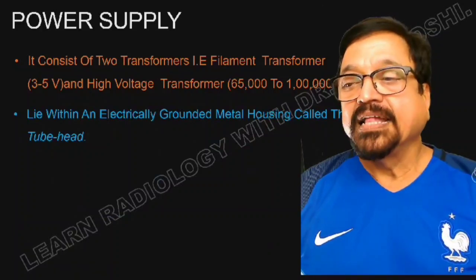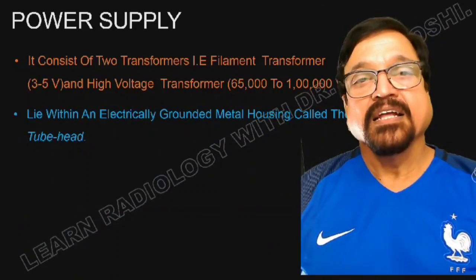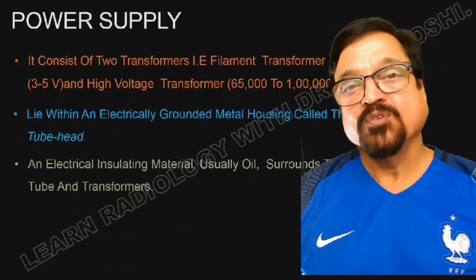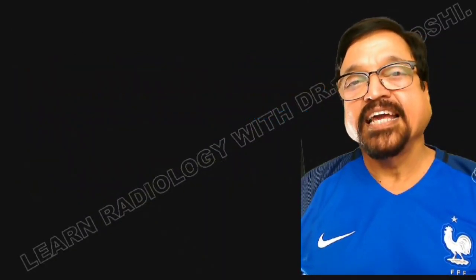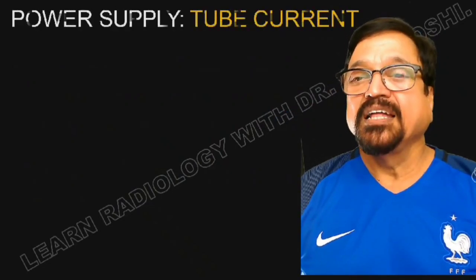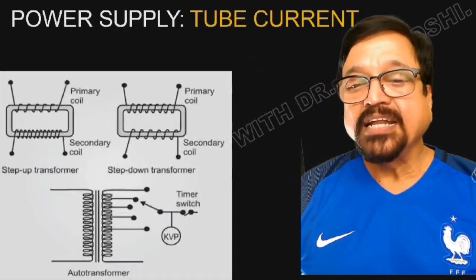Now one transformer is a filament transformer, and the other is meant for the tube and exposures. Now the transformer is a totally different topic, and it is also covered in the same series somewhere else. Here it is just to give you a brief idea about the components of the X-ray machine.